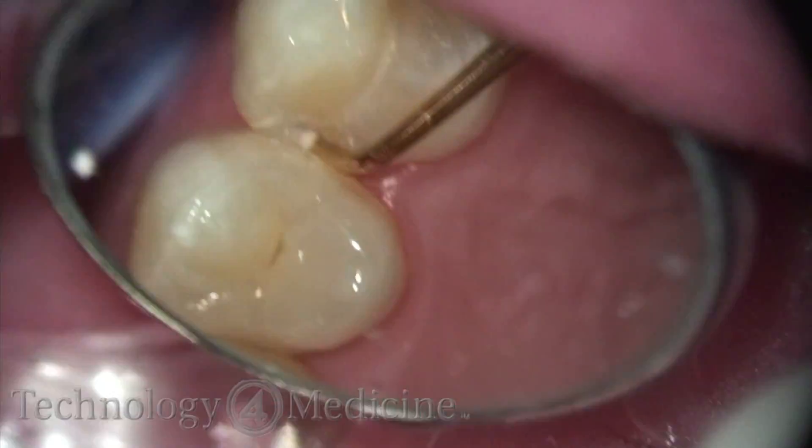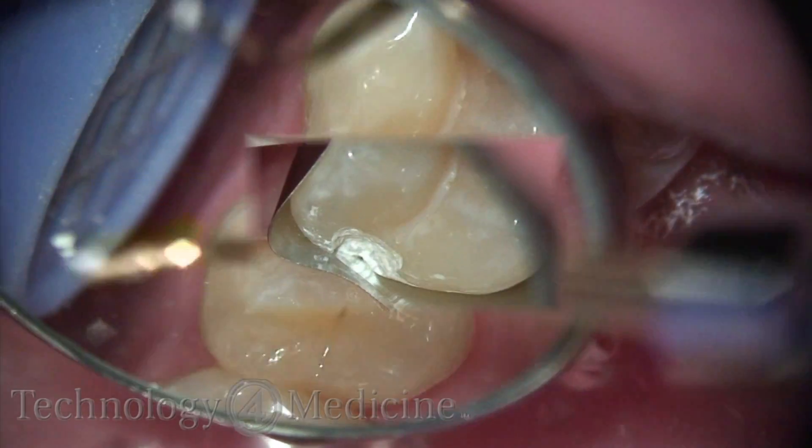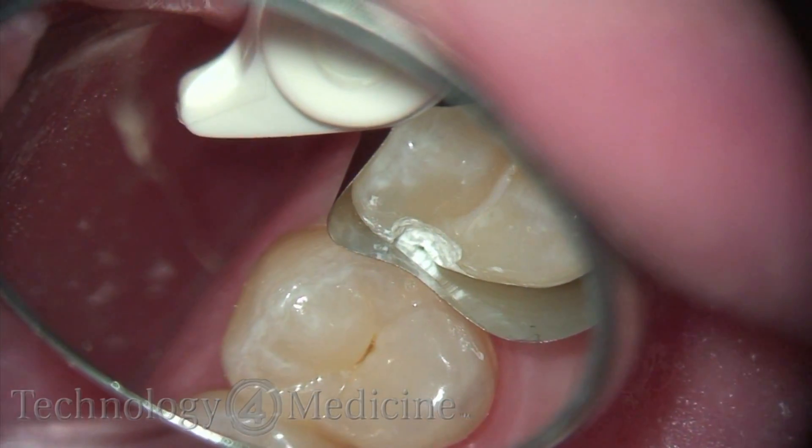You can use a slow speed here. Again, this is all done without local anesthetics. I'll place the band gently and restore.